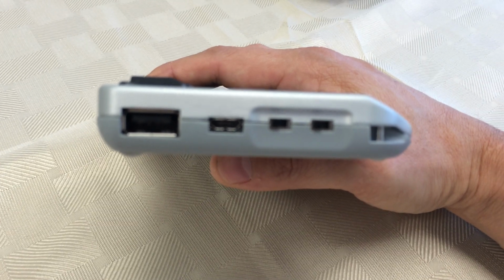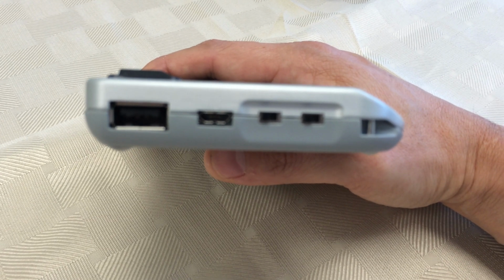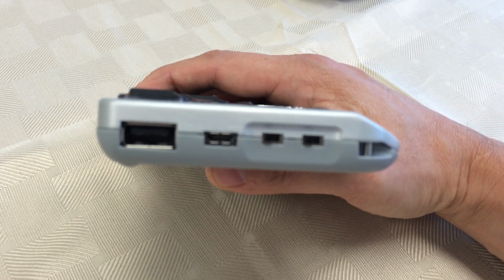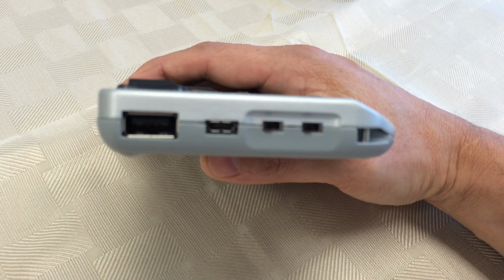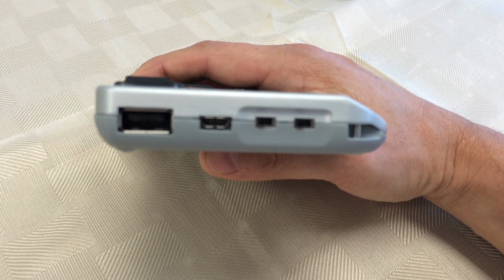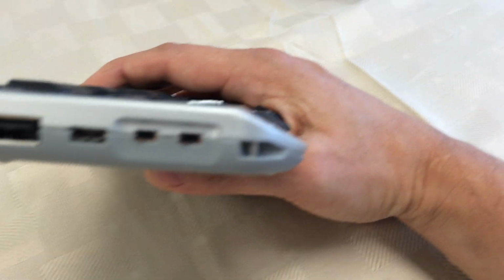There's then a micro USB, and that's what we use actually for both charging the device, so we charge through a USB adapter, or you can connect to your computer and actually use VarioUltra as an external drive. More on that in another video.